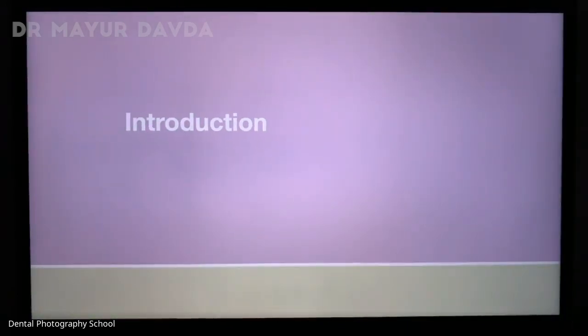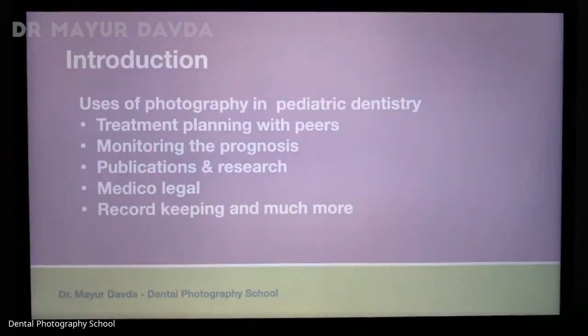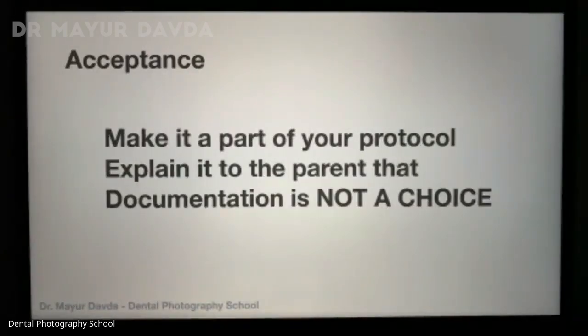In the introduction, we spoke about why dental photography is important. We have more than 50 applications of dental photography in dentistry, including treatment planning, monitoring, prognosis, publications and research, medical, legal, and insurance purposes, and record keeping, and much more. A couple of challenges that we face is acceptance by the patient, especially the child. So you have to make the parents understand that dental photography is a part of your protocol. It is not a choice, and you do document for each and every case. So the parent or the guardian does not get a choice whether to decide or not. Documentation is vital, and you have to document all your cases, especially nowadays.